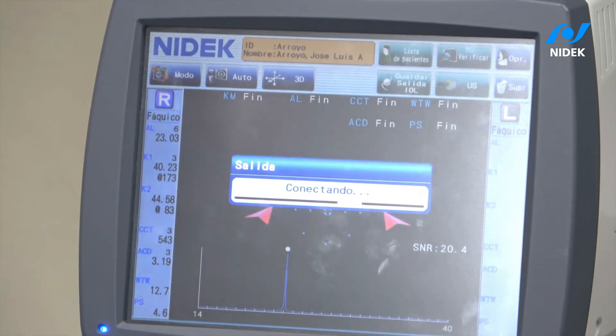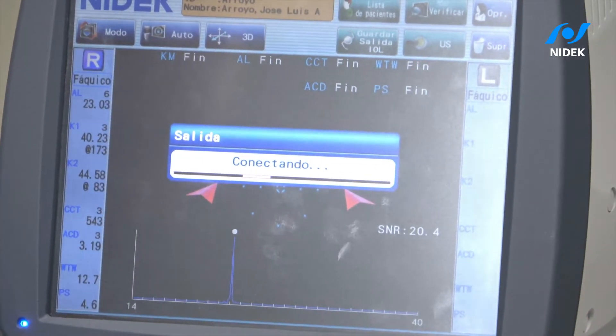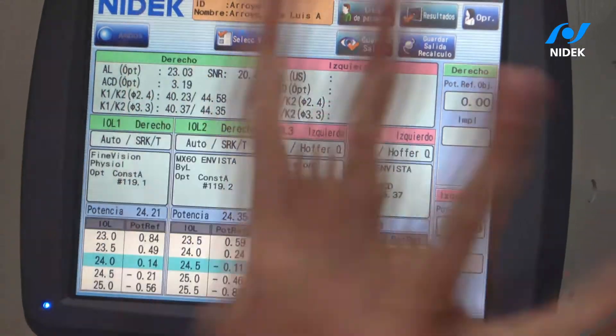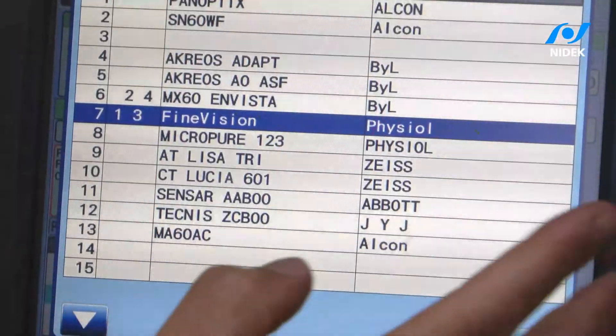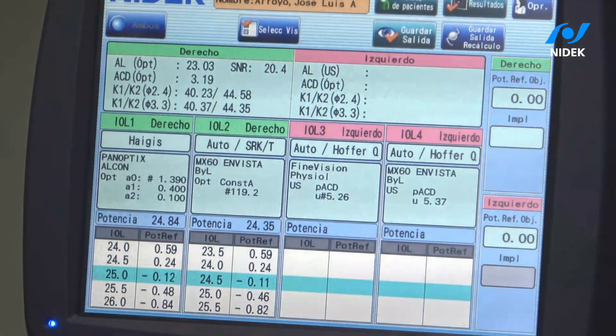As you can see here, it's doing all the measurements and the connection in order for me to pick the IOL and to pick the formula. Look at this — I already have all the formulas. In this case I'm going to select Hoffer Q and then pick one of my favorite IOLs, which is the PanOptix.